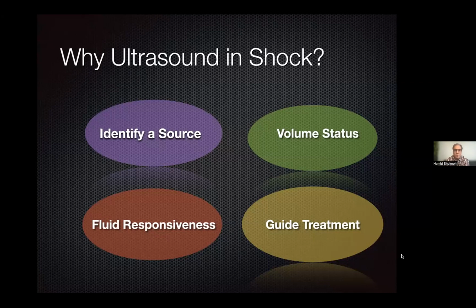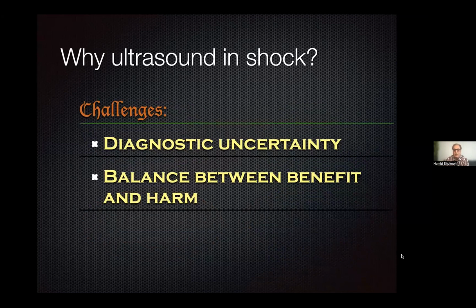You do not want to spend 3 hours providing fluid, treating the patient, and after 3 hours find out, oh, this patient was not fluid responsive. It also guides all the treatment that we have. You just put the probe on, identify a pericardial effusion as the source of shock, and immediately you grab your needle and do your pericardiocentesis. So it helps guide the treatment and the procedures that you need to do.